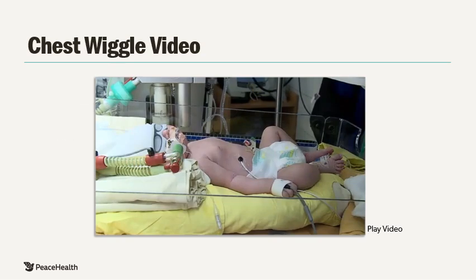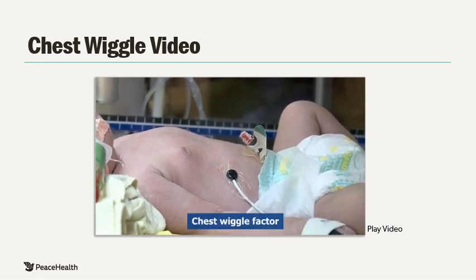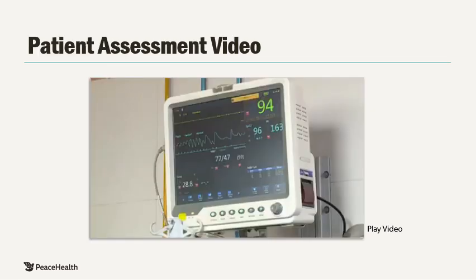Here, we can see a good representation of continuous and equal vibration in the chest from the nipple line to the umbilicus in the neonate. This is what we would consider chest wiggle factor. In this video, we will see a patient assessment.